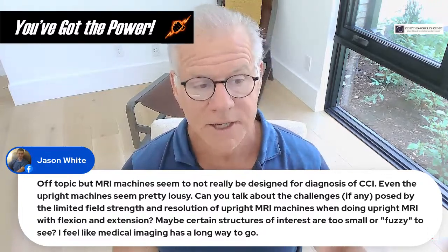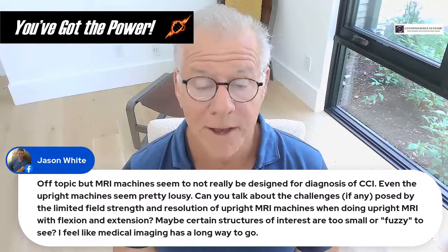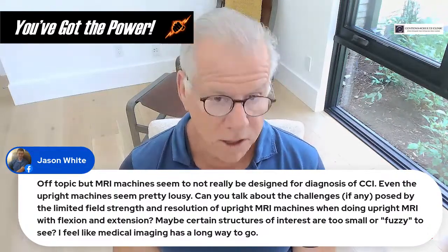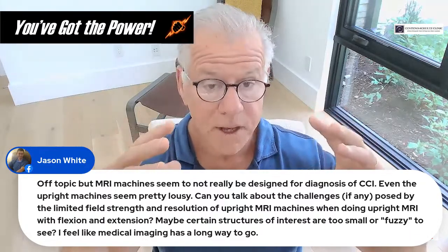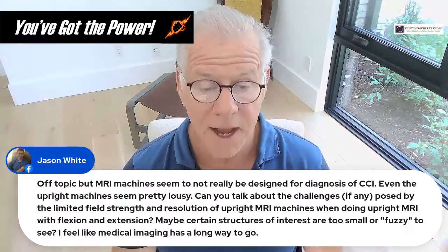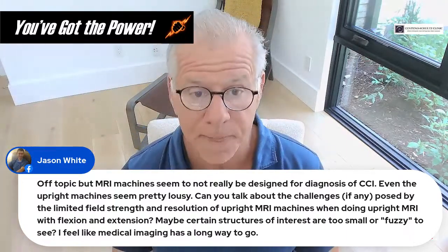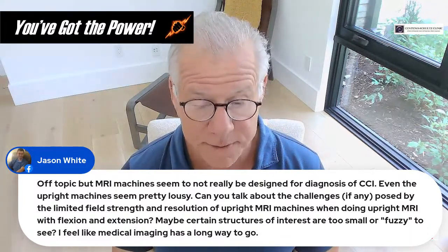Yeah, I think Jason brings up an important point here. We have two kinds of MRI out there, two different concepts. One is a closed bore, where you go into a hole and the machine is around you. The good news about a closed bore MRI is it's higher field in general, and we tend to get much crisper, better pictures.